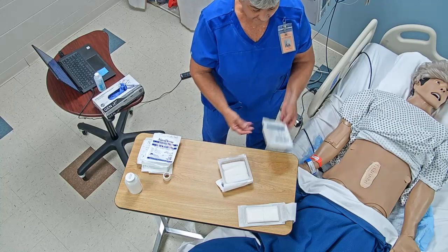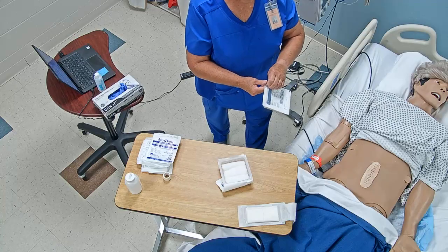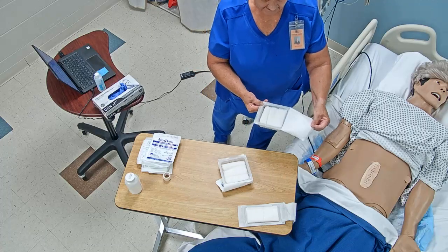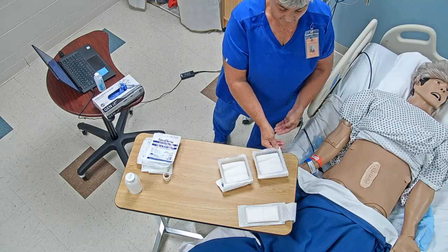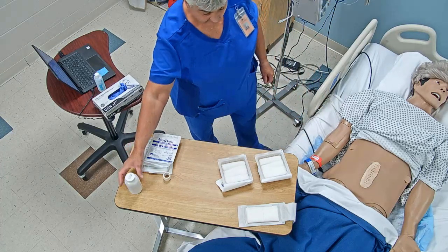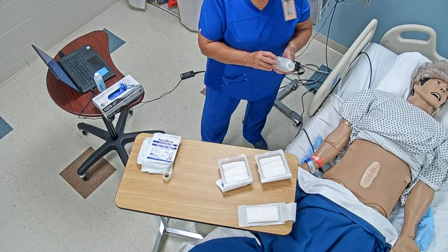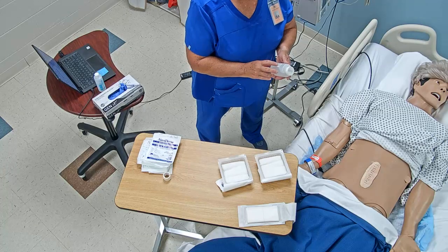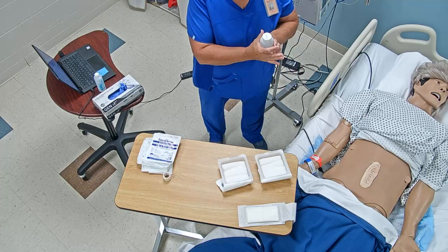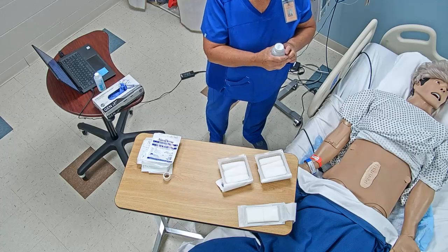So this is going to be my dry dressing, or the dry part. Again, I'm going to open this away so I can see the contents. Okay, again, making sure my thumb is not going over the edge of that. And so I have my normal saline here, 0.9% sodium chloride, and so I'm going to palm the label so that it doesn't get messed up. So I'm palming the label.